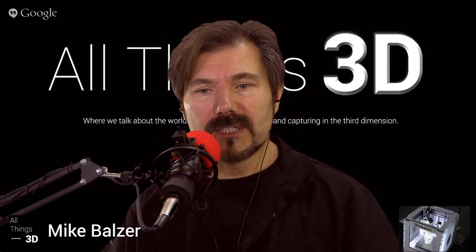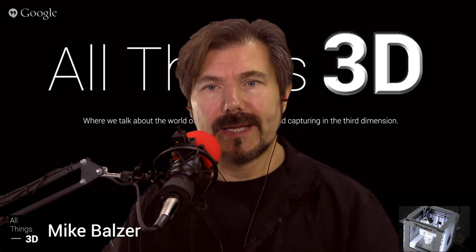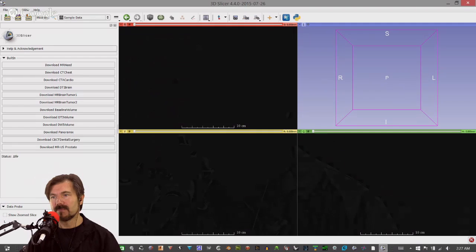Okay, so what I'm going to do now is jump to the actual screen, which is right behind me now. And this is on my laptop. Now, the strength of this 3D Slicer is you can pretty much use it on anything. This is about an $800 15-inch laptop. It's an Asus. It does have discrete graphics.